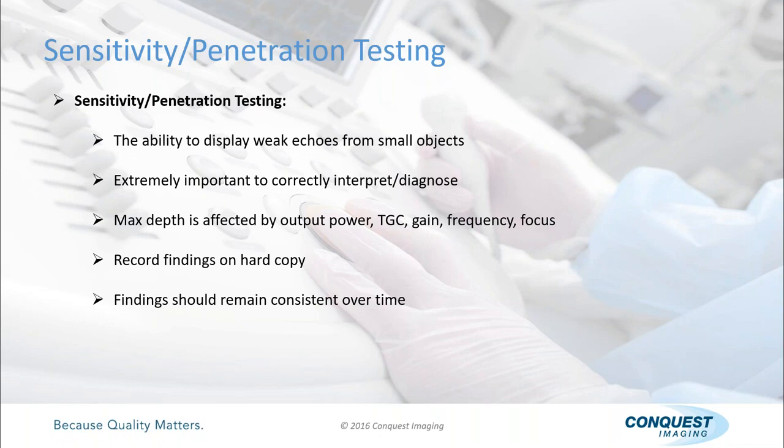Whatever you got to do to have hard copies, it really benefits you, the engineer, to troubleshoot later on when they're needed. If you're ACR accredited, American College of Radiology, again, you have to have hard copies. They haven't changed that yet. So for those of you who say, well, I have an EMR or I store them in my computer system, as long as your auditor lets you get away with that, great.